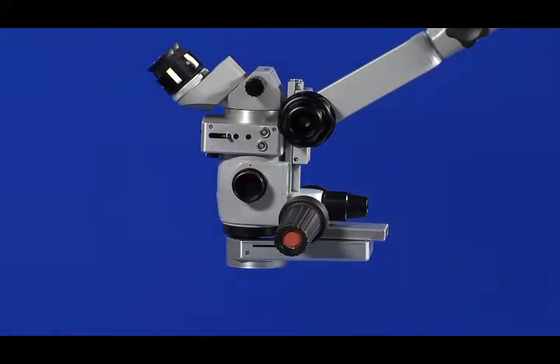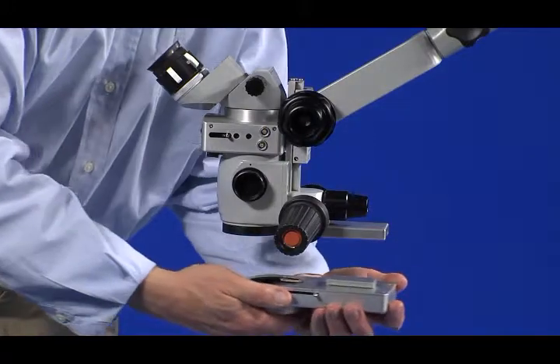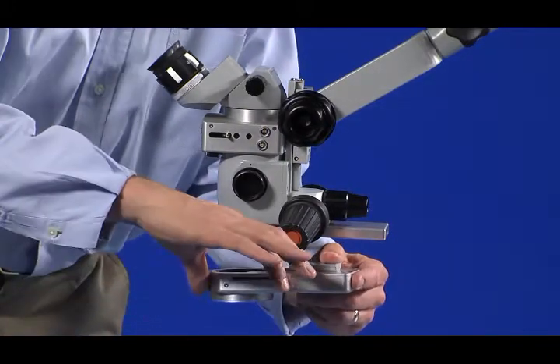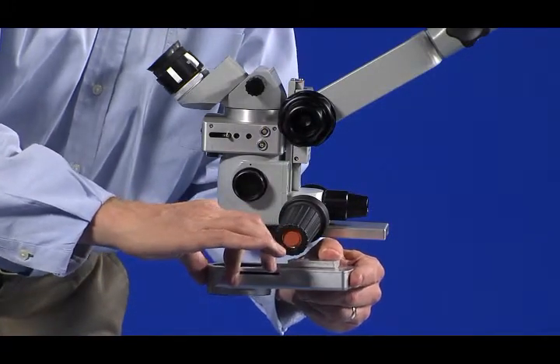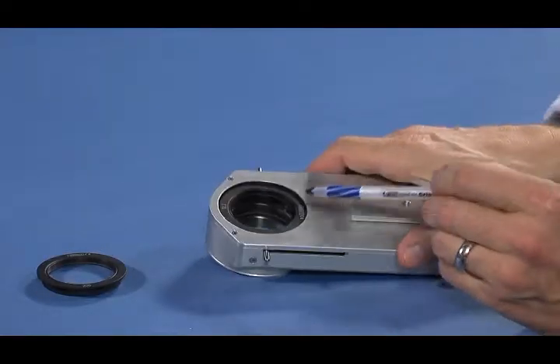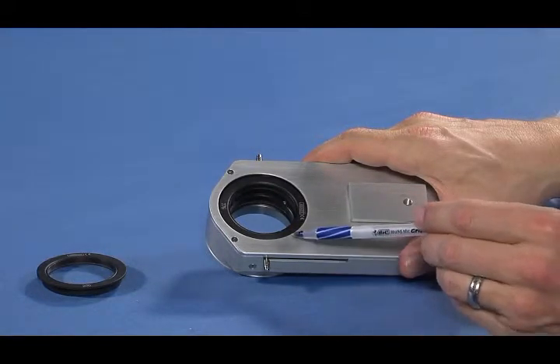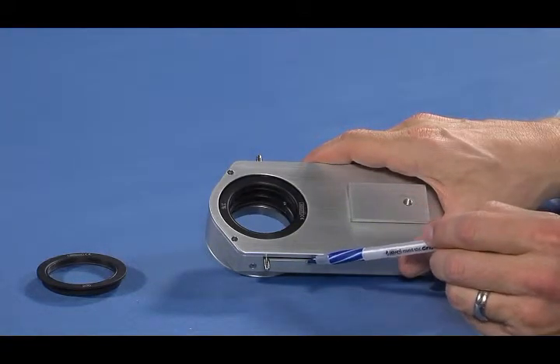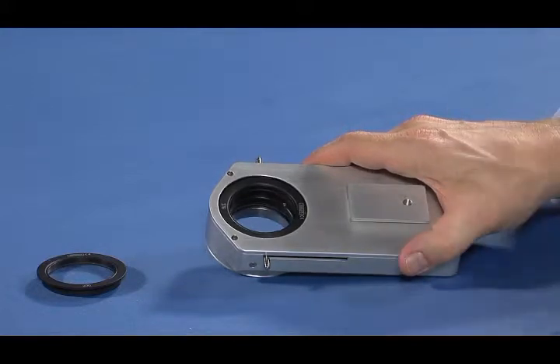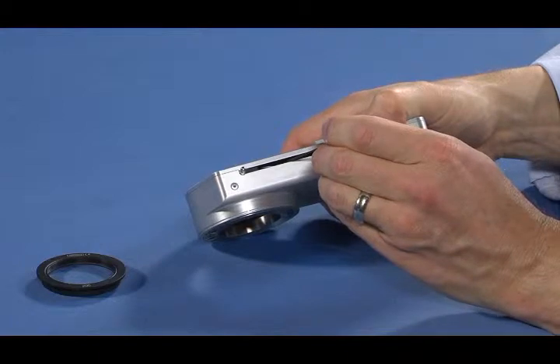First, the CLA must be removed from the microscope in order to access the condensing lens. Next, the condensing lens must be moved to its forward location. The condensing lens is held securely in place by a small set screw located inside the CLA housing. It is accessed from the right side of the CLA. This set screw must be loosened in order for the existing condensing lens to be removed.